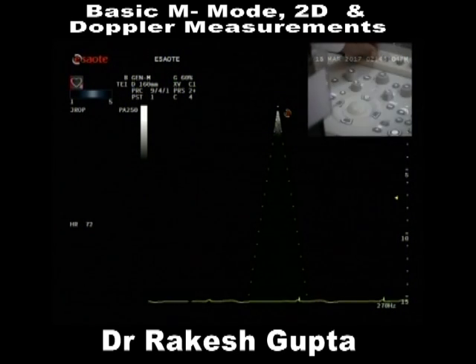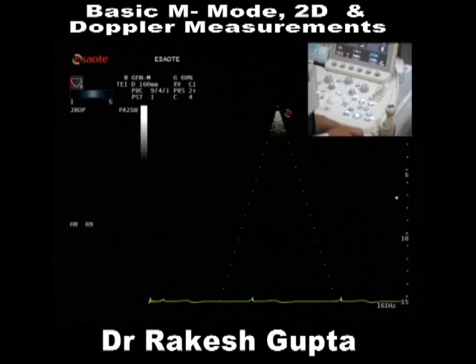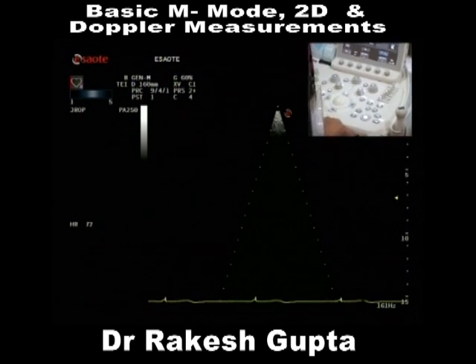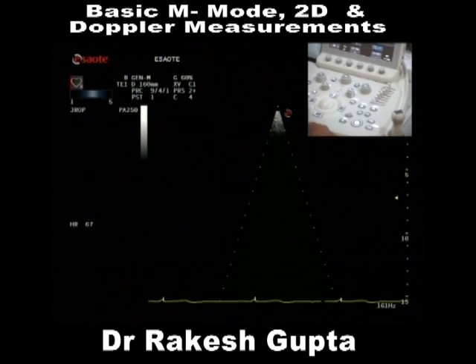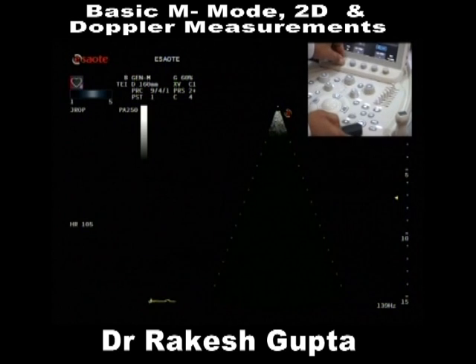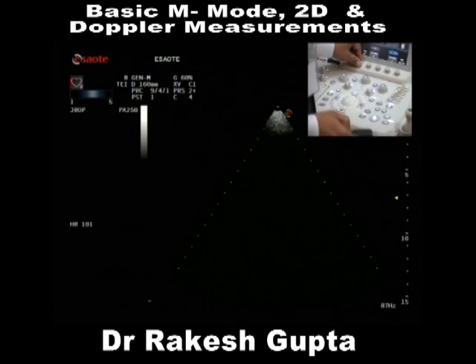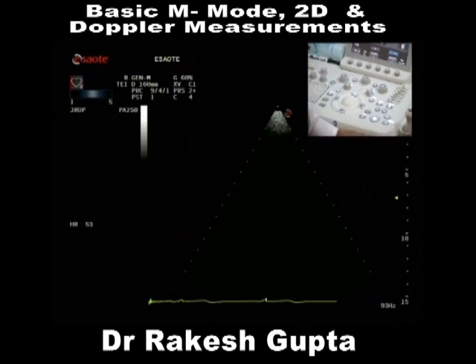278 frames. So if this angle of interrogation is 35 degrees, my frame rate is almost 160 frames per second. And it's changeable, as Prashar sir said. As I am increasing this sector, the frame rate is decreasing. This frame rate will further decrease.